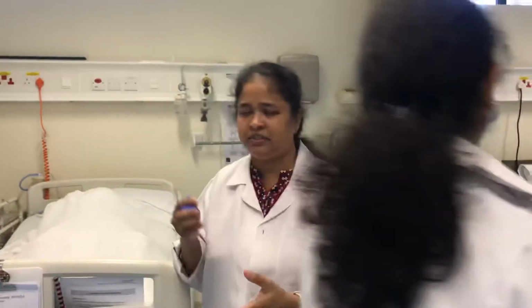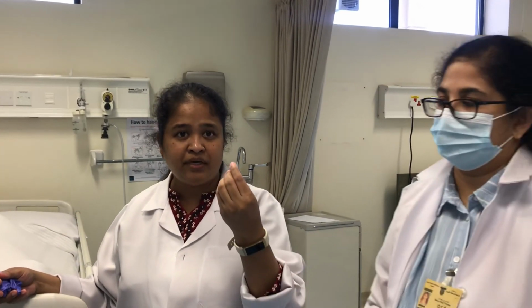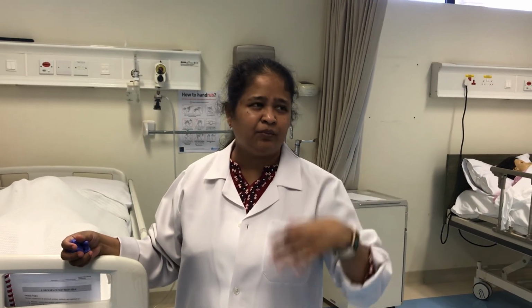And then after which they may have to give perineal care and observe the patient. Actually, when you are removing it, you should instruct the patient about some exercises also, because dribbling may be common if they are on a catheter for a longer duration. So we will have to teach them the Kegel exercises, pelvic exercises, and drinking more water.